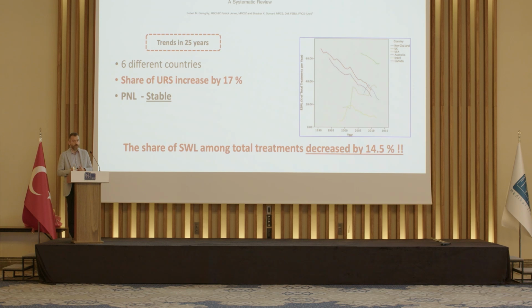And this is a more global perspective from different countries, including Brazil, Canada, Australia, New Zealand, UK, and USA, and a longer follow-up of about 25 years. And again, we can see that the rate of use of the shockwave lithotripsy is decreasing almost everywhere. And in this study, the total share of shockwave among the total treatments decreased by 14.5% in about 25 years, and in the recent years, this drop is more dramatic.